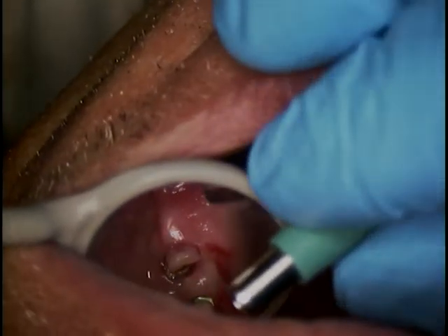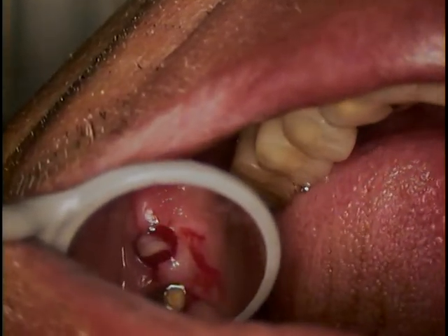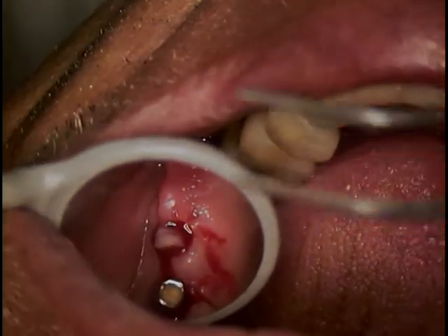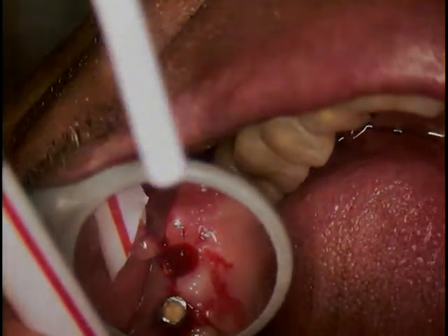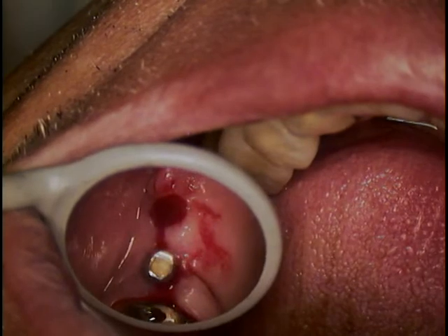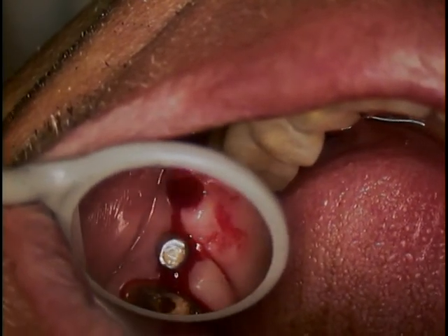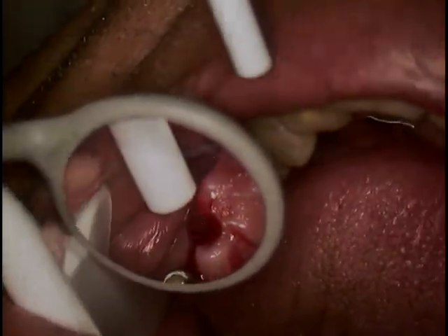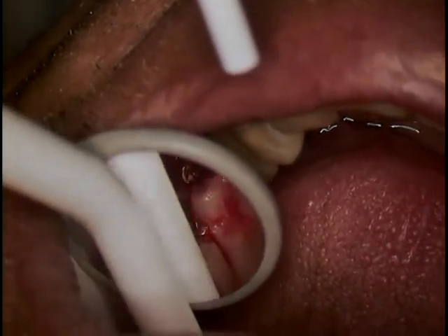I'm right on top of the implant now, seating it. Cotton plier. Can you get a little surgical suction tip in there for me? Let's have another cotton plier. Surgical suction, please — go right up in there. Let's rinse that.